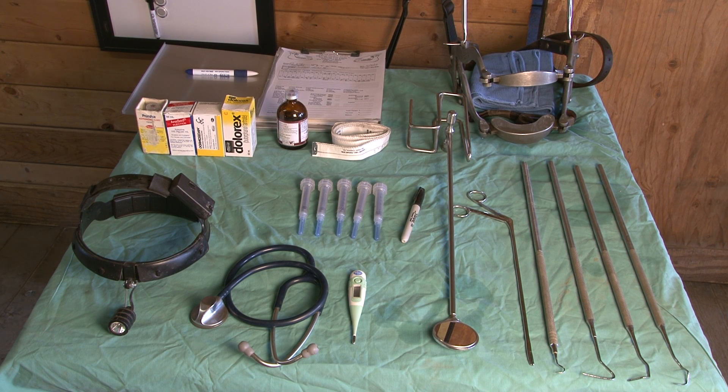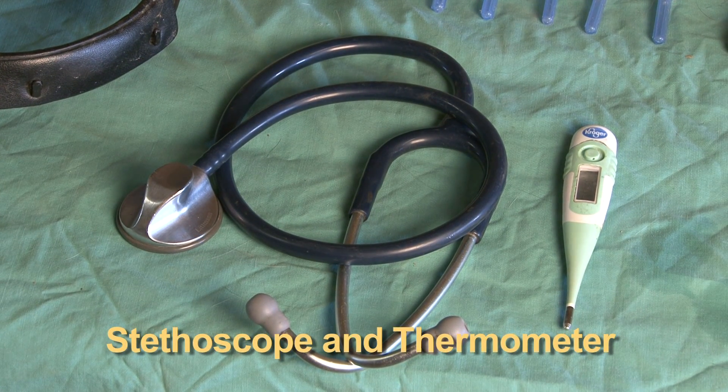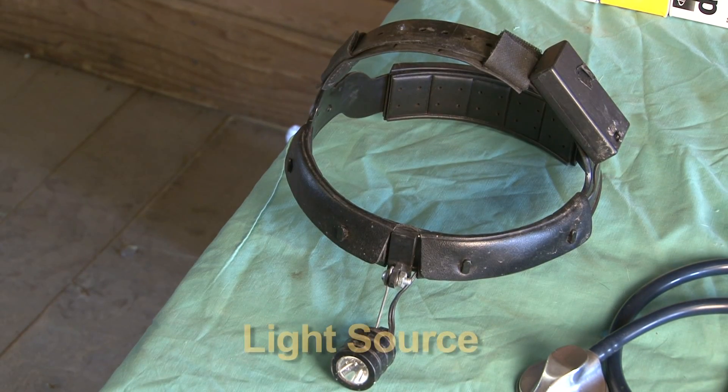On each horse that we see, we always do a complete external exam, and for that you just need your stethoscope, a thermometer, and a good light source, like the headlight on the left.